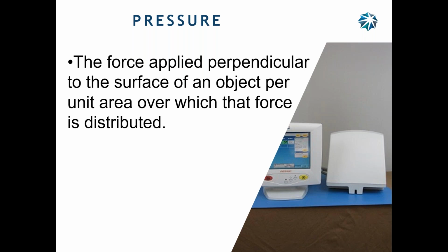Well, if you're dealing with a CVI, that's the motor. Okay? That's the motor. It weighs about what, 20 pounds? It's heavy. Why? Because it goes up to 1200 psi to push your fluid through that tiny little tube, what we were talking about, the diameter.